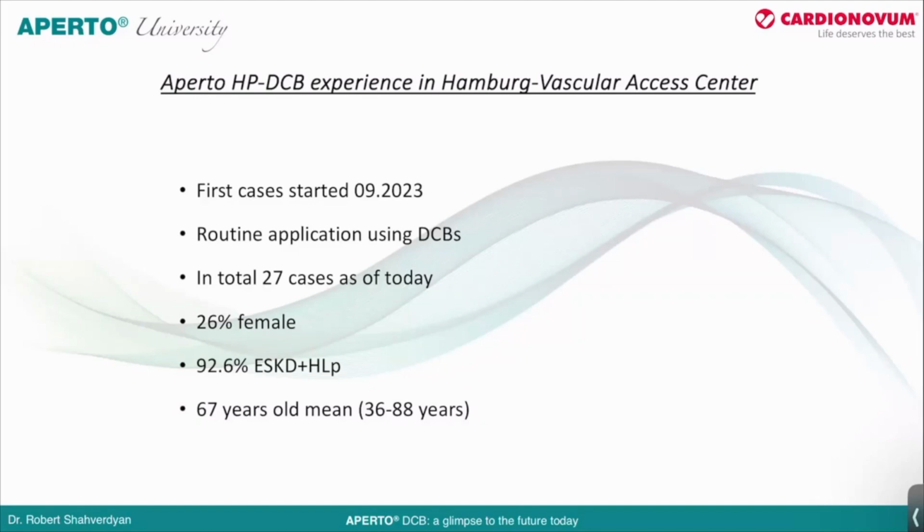One of the reasons was also, like Dr. Kitru said, that when we use a drug-coated balloon, we should extend the balloon longer than the angioplasty balloon we use for vessel preparation. Hence, we probably create, I'm not sure, more damage to the lesion or to the healthy vessel outside of it, because we see that the recurrent stenosis might be longer and heavier in the patients.